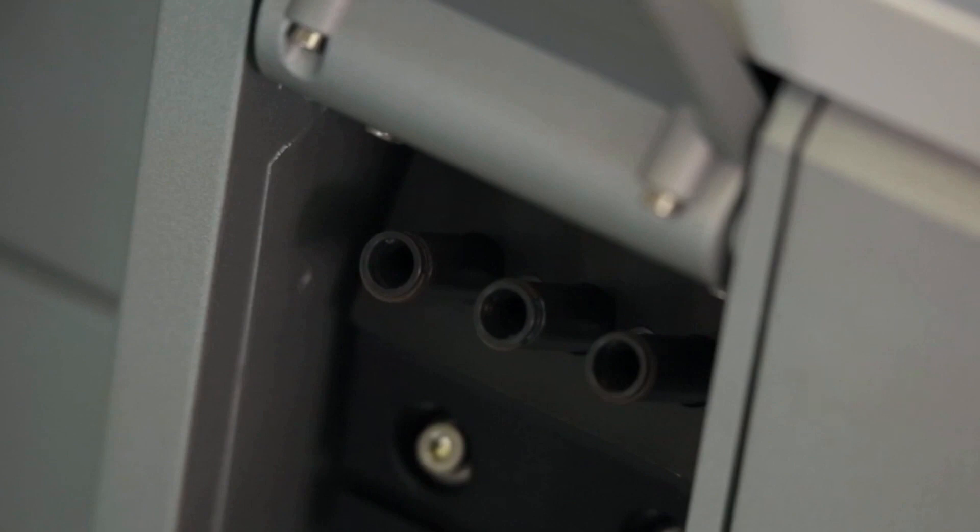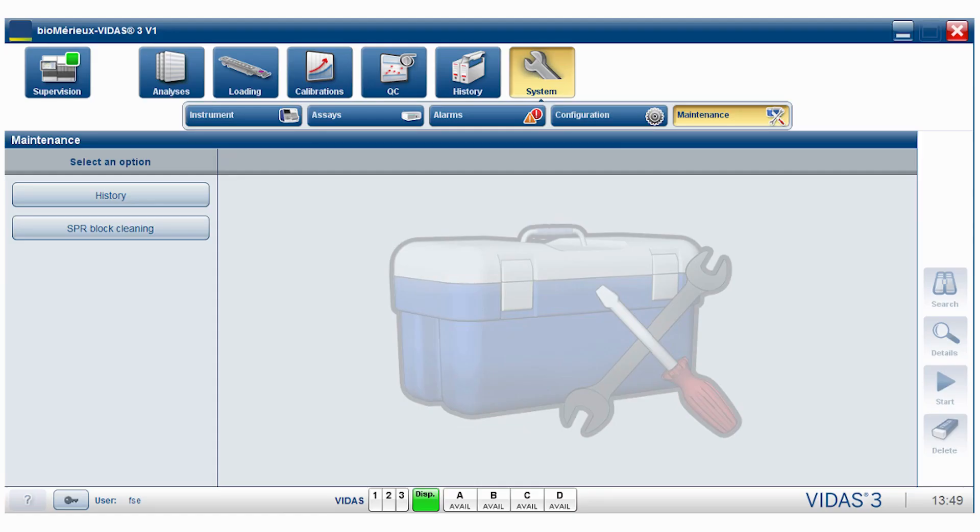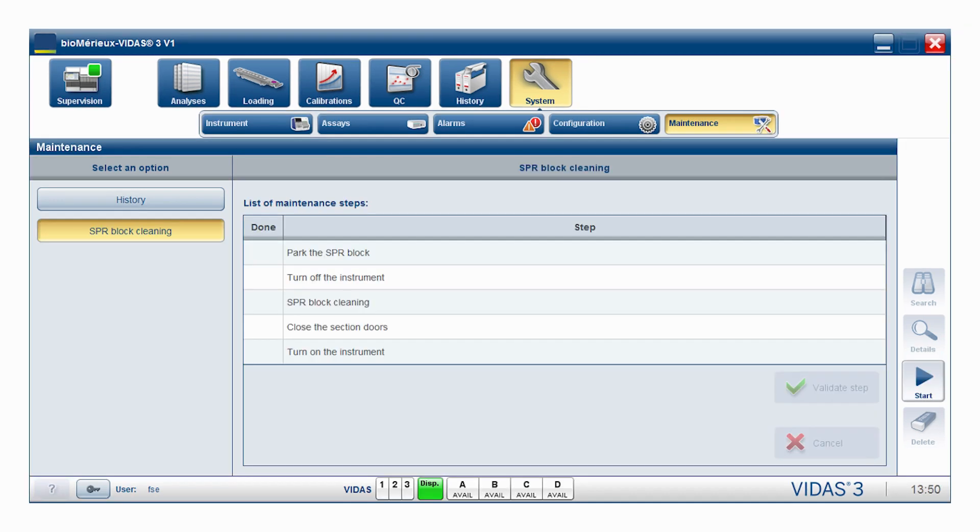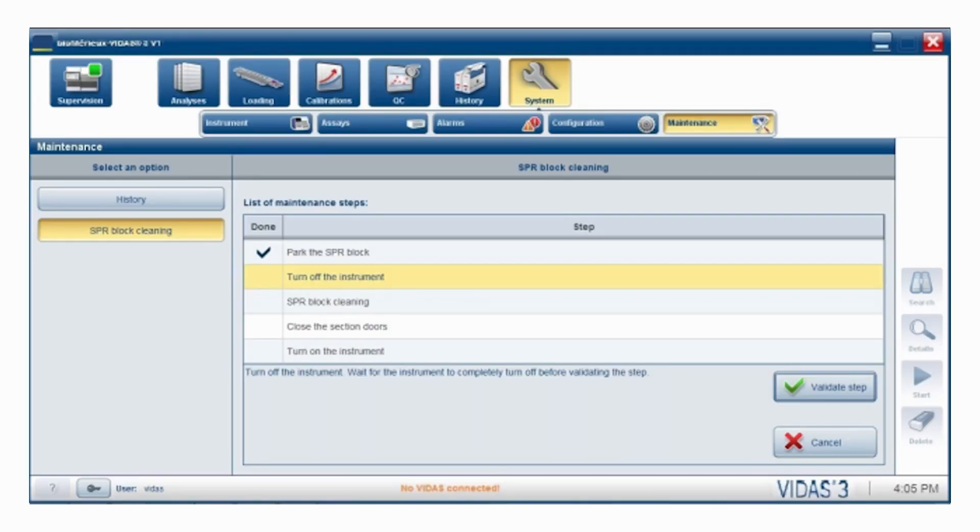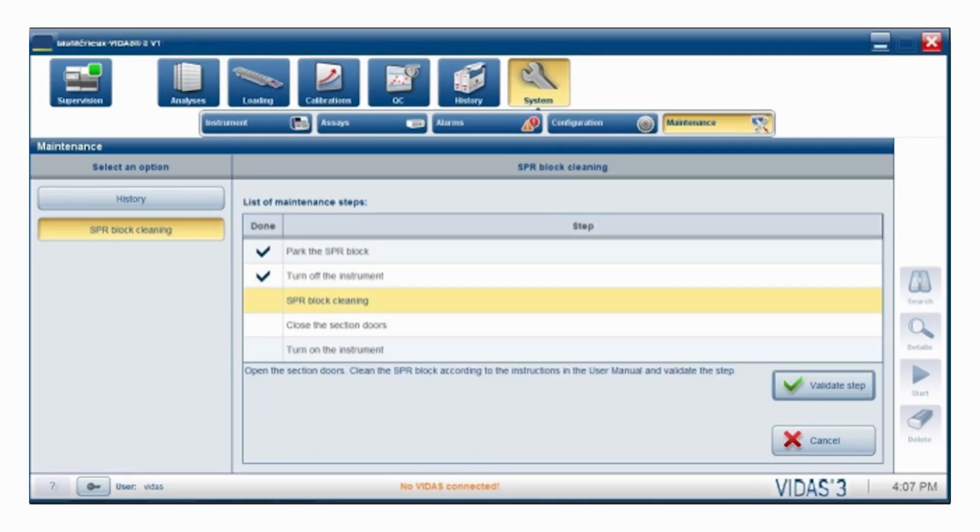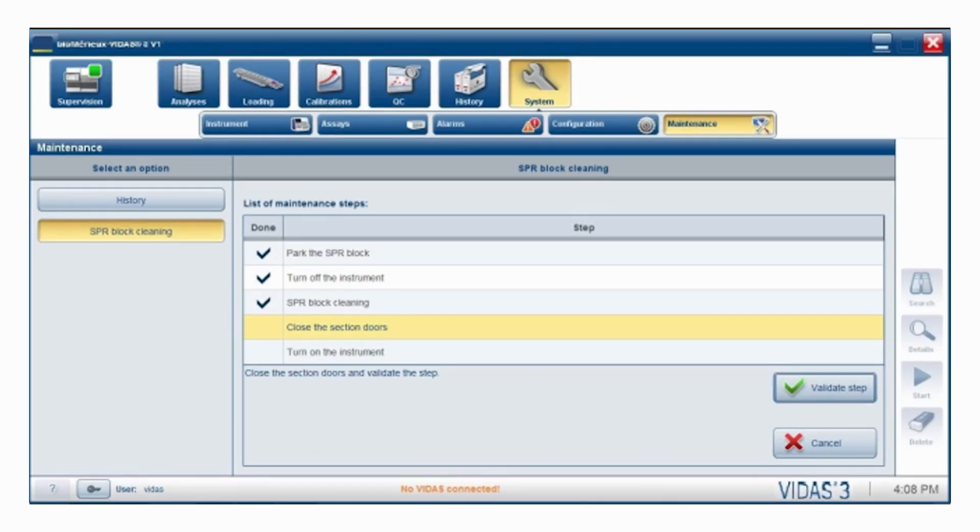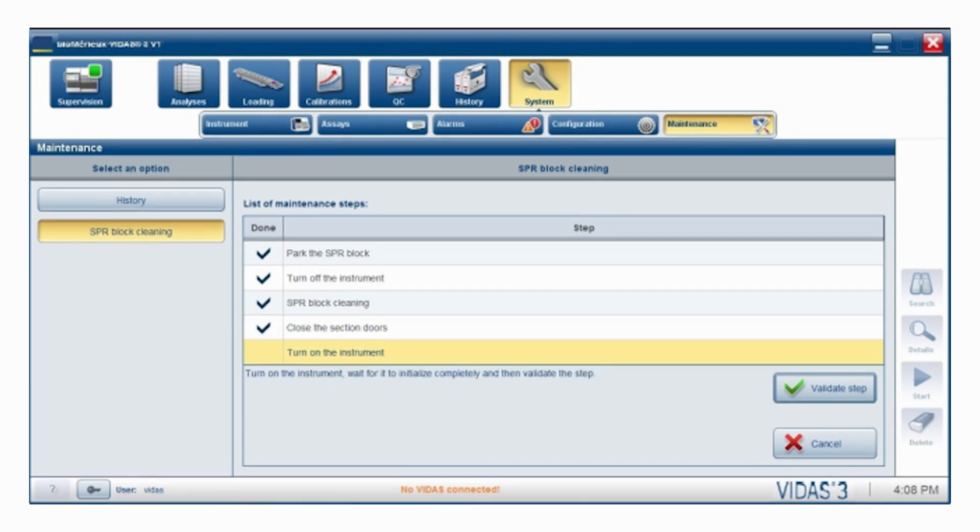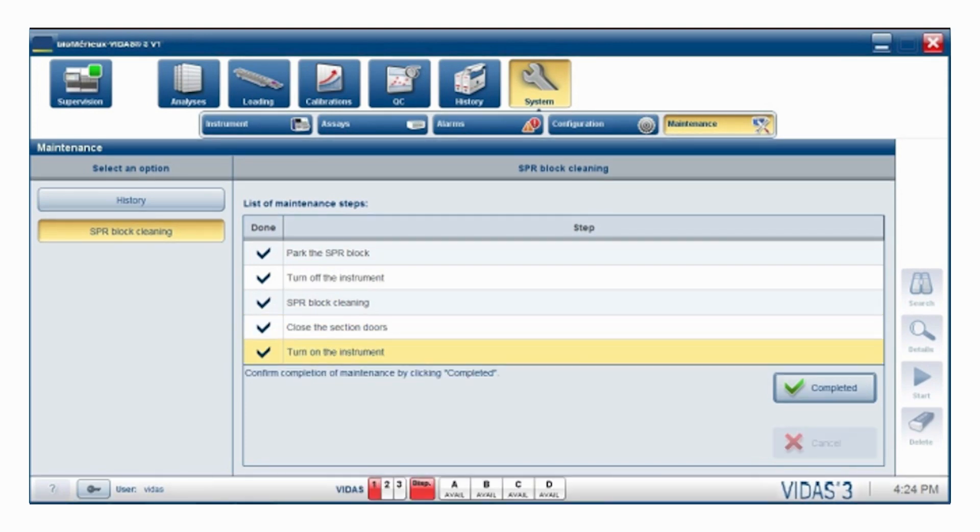Vitus spur blocks need to be cleaned monthly. The spur block cleaning procedure is initiated from the spur block cleaning area under System Menu Maintenance. It provides step-by-step instructions for cleaning all section spur blocks. Follow the on-screen prompts to perform the spur block cleaning.